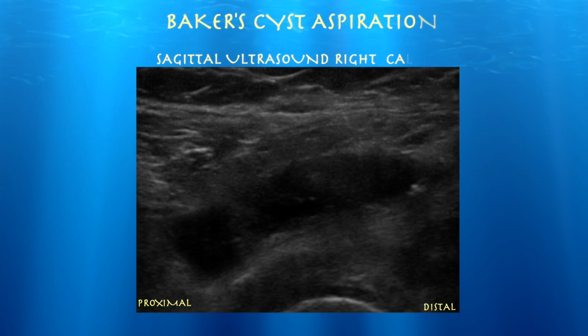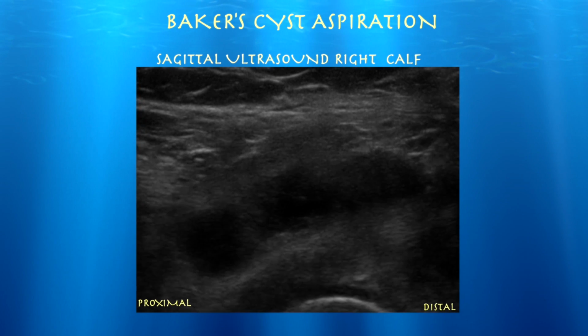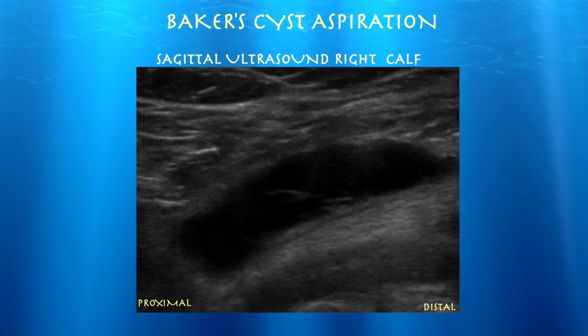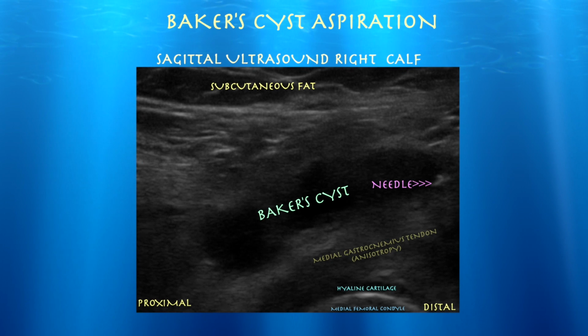And here we are in the sagittal view of the Baker's cyst. We're going in with a needle now and essentially draining the Baker cyst. We basically drain from the distal pole.